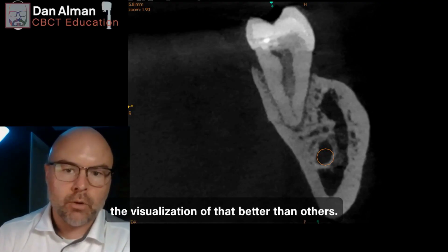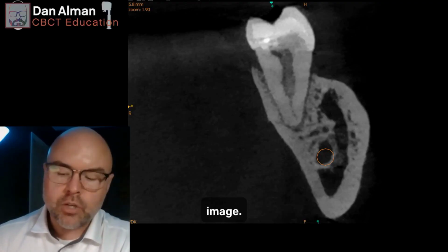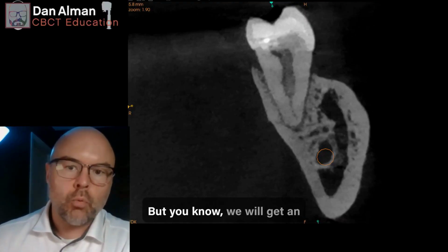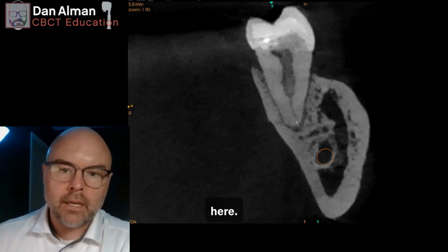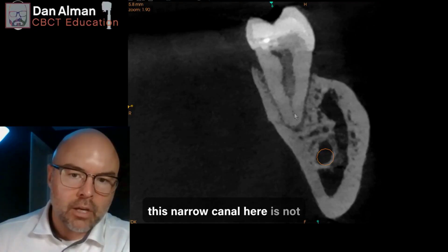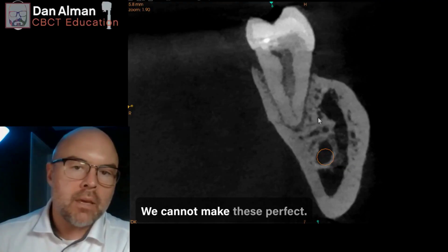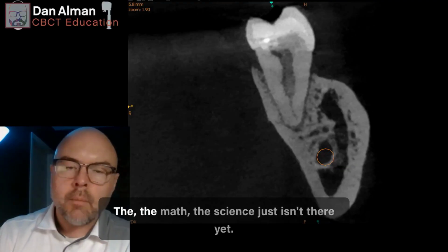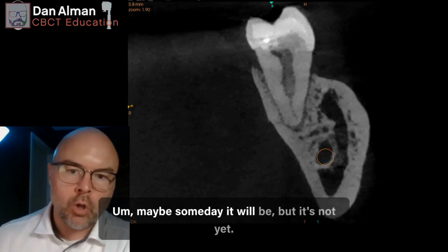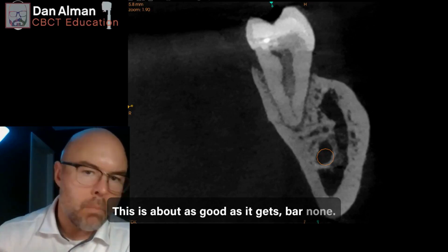better than others. Okay. Now, what we're looking at is a static image. All of the images here are going to be static, so it's not the best thing, but we will get an idea of what we're looking at here. What we are seeing with this narrow canal here is not entirely perfect. We cannot make these perfect. The math, the science just isn't there yet. Maybe someday it will be, but it's not yet. This is about as good as it gets, bar none.